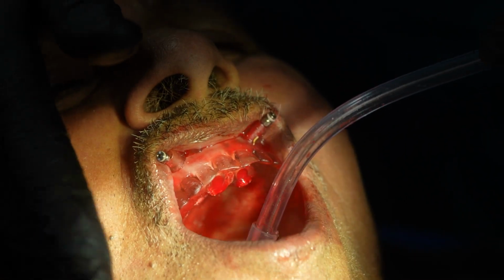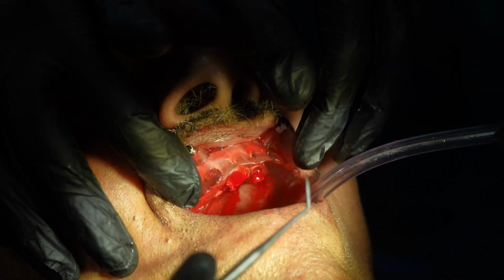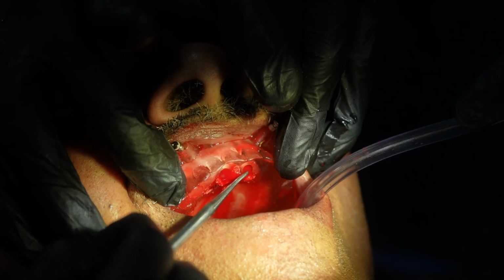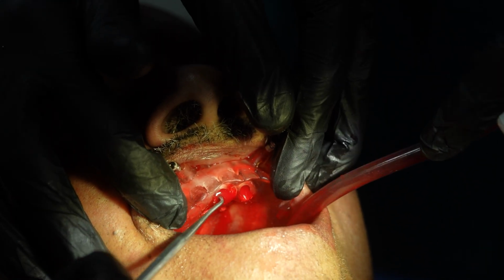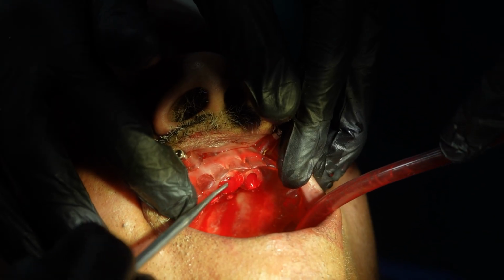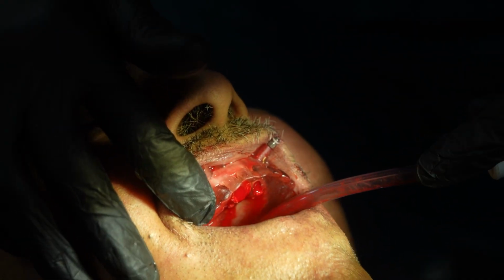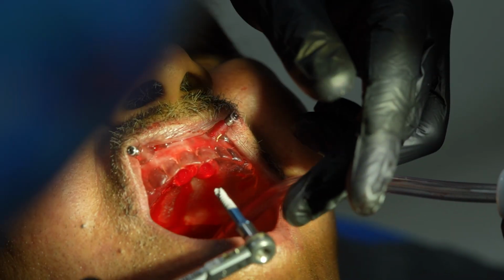I will just check once with my probe, just to have a double check that I am completely within the bone. So I will see the buccal, lingual, similarly buccal. I will go and place the implants. What we want is this part of the blue ring should go and flush with the guide.